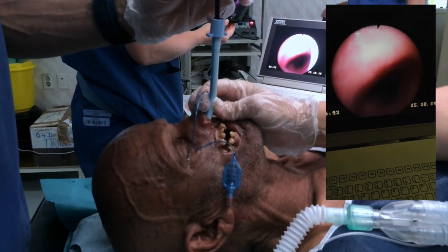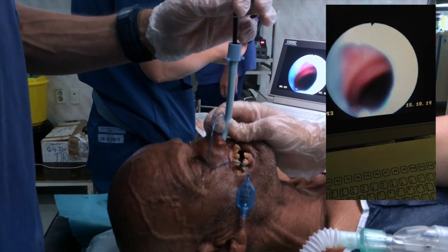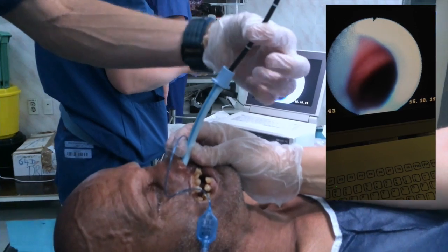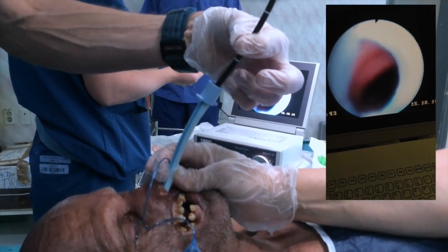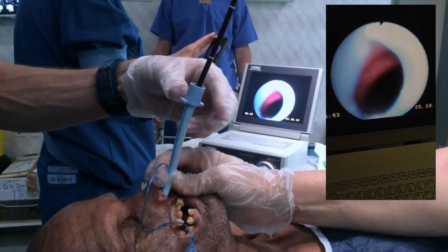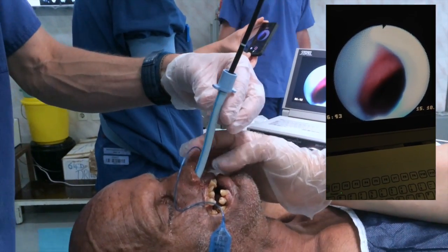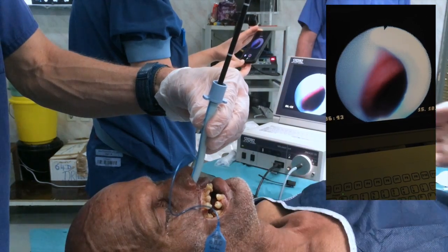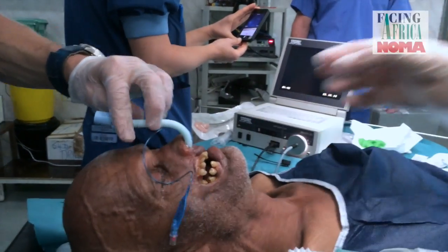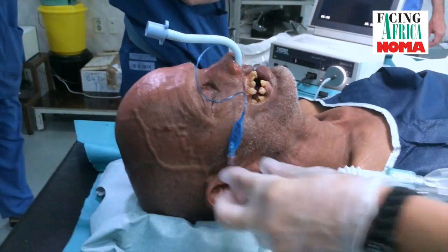I'm going to measure the distance before we enter the tracheal tube. So there we are, that's the tip of the tracheal tube. If you look where my fingers are, it's a 5 centimeter distance from the carina to the tip of the tube. That's super, and that's where you'd expect the bend to be on the north-facing polar tube anyway. So I'm going to just withdraw the scope all the way. That's us. Great. So now we need to inflate the cuff.